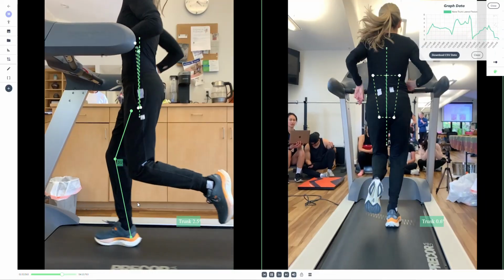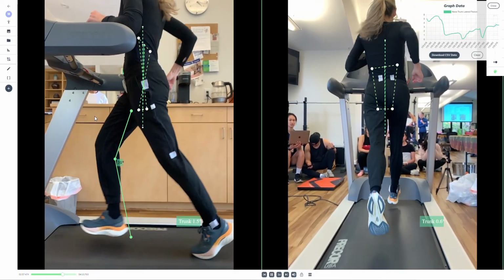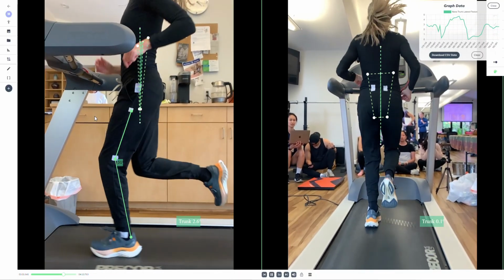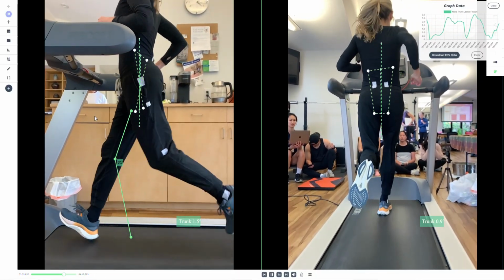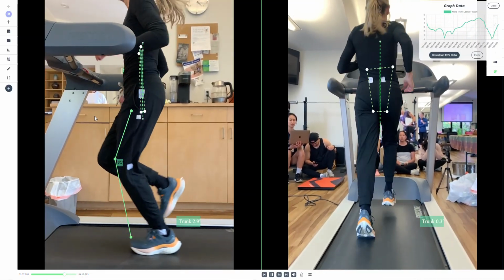And so that is the running analysis using a combination of an iPhone, which could be any high-speed camera over 100 frames per second. In this case, it was 240. The Yager app, as well as Microsoft Excel.